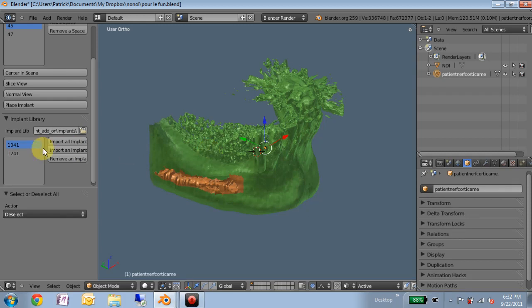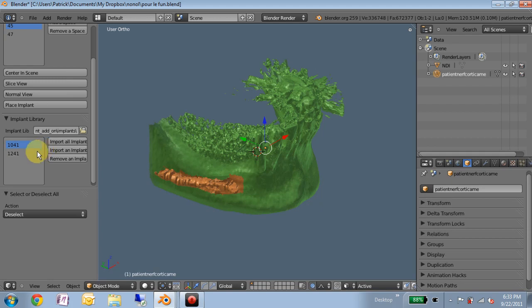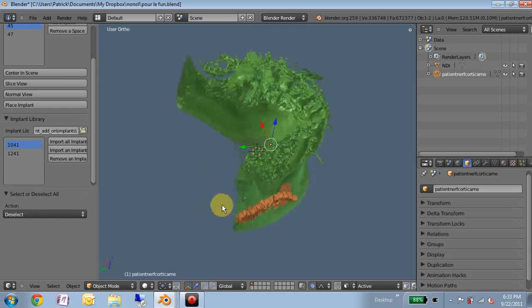The reason I did that is I could imagine someone eventually having an implant library consisting of several hundred different types, sizes, varieties of implants where it wouldn't be efficient to have them all loaded into the blend file. It wastes a lot of computer resources. So this keeps a link and doesn't actually pull the file in until you need it.